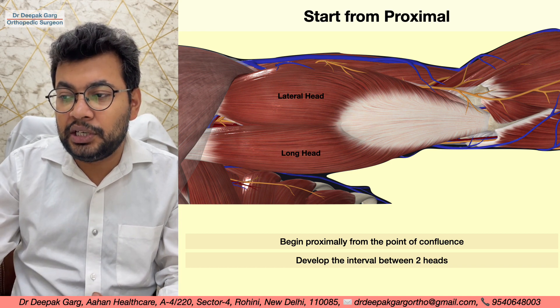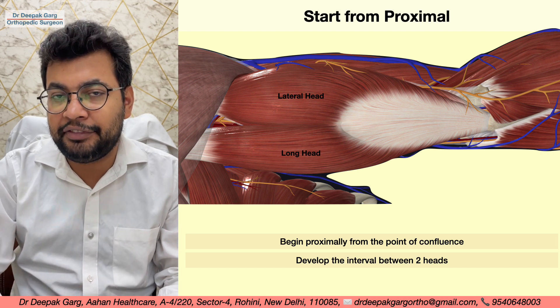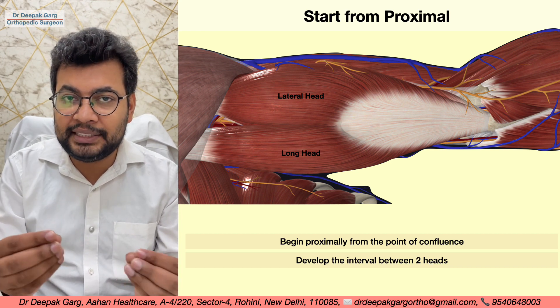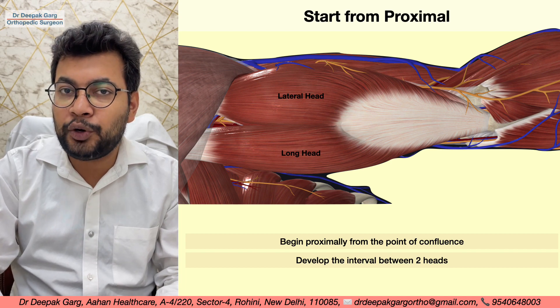As we separate the long head and the lateral head, we continue proximally until we identify the gap between the long head and the medial head, and identify the vessels. There may be multiple small vessels in between that we will need to identify and coagulate.